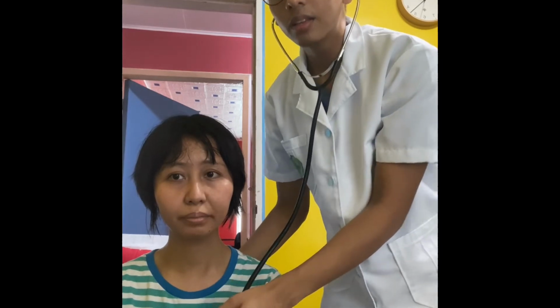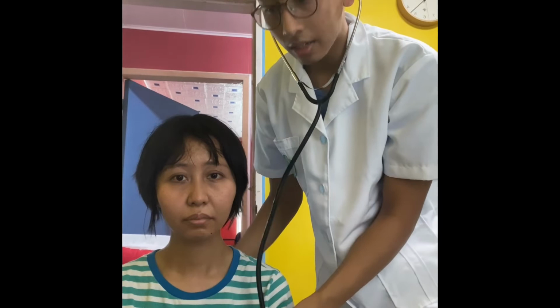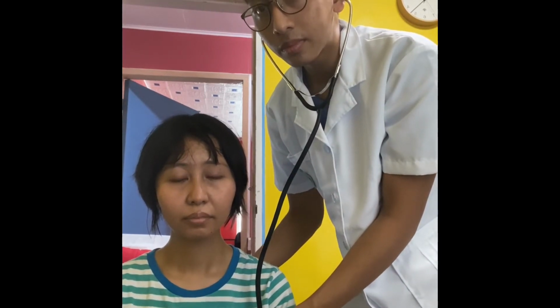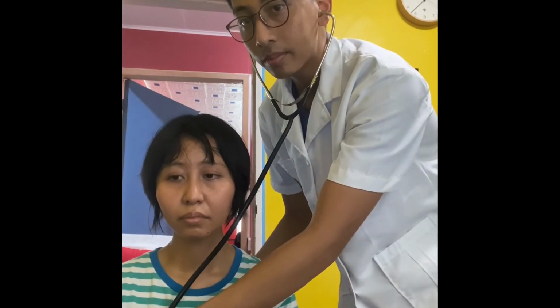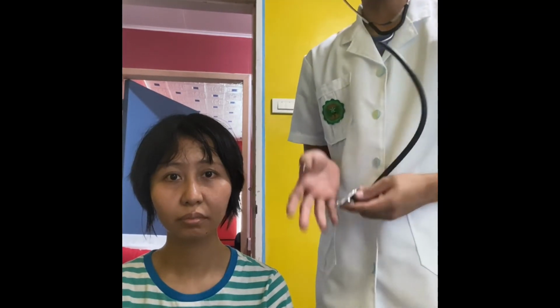Alright. Then we go to the lateral side of the nipple. So inhale, exhale po, miss. Inhale, exhale. Then, last but not the least, in the lateral side of the nipple, we're assessing the lateral segment of the right middle lobe and the left upper lobe.